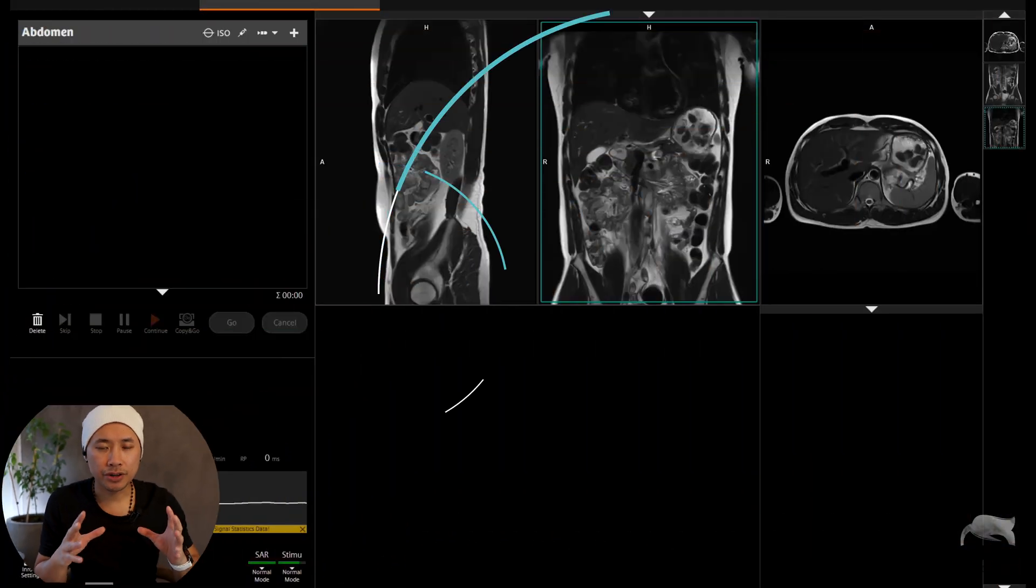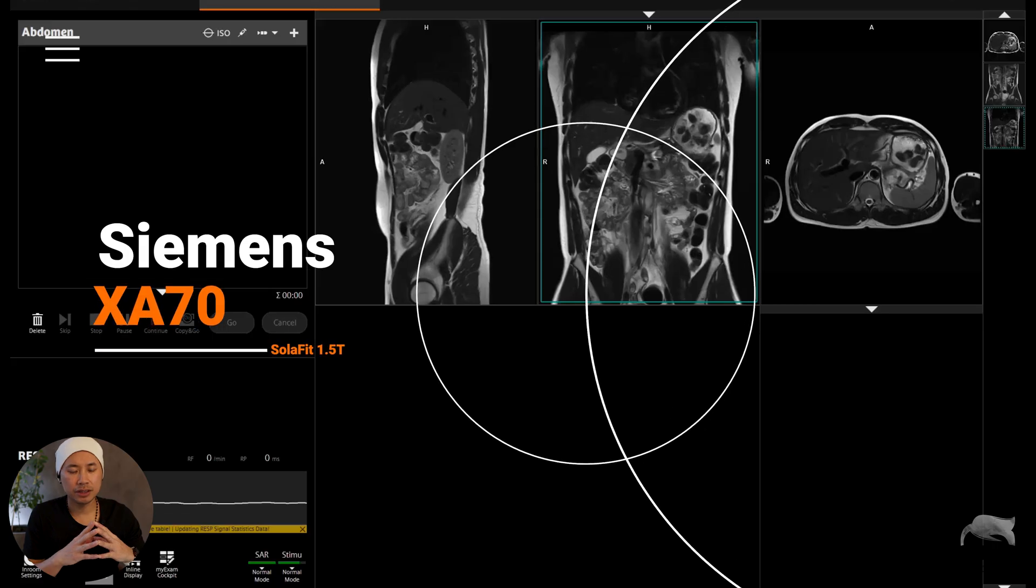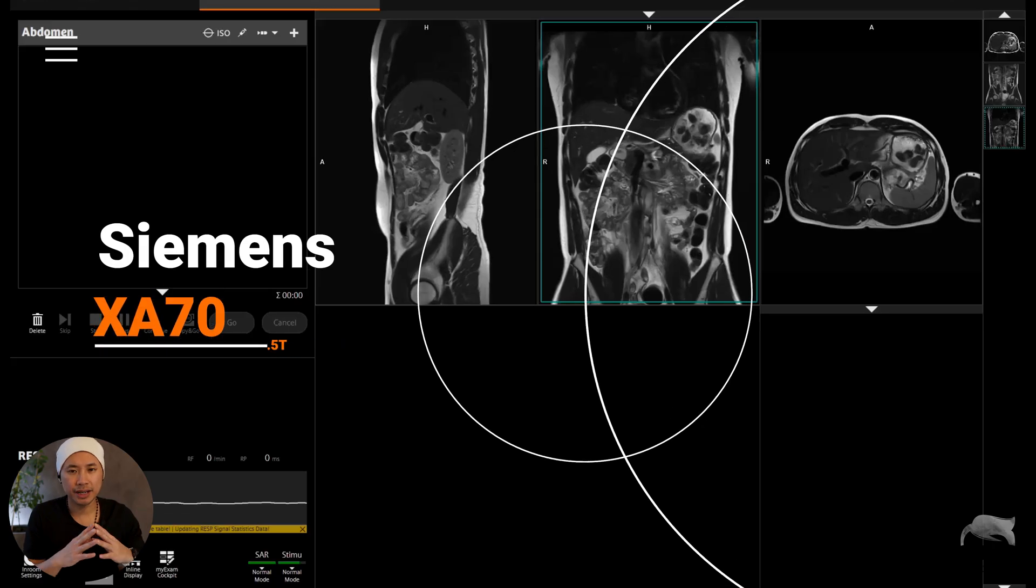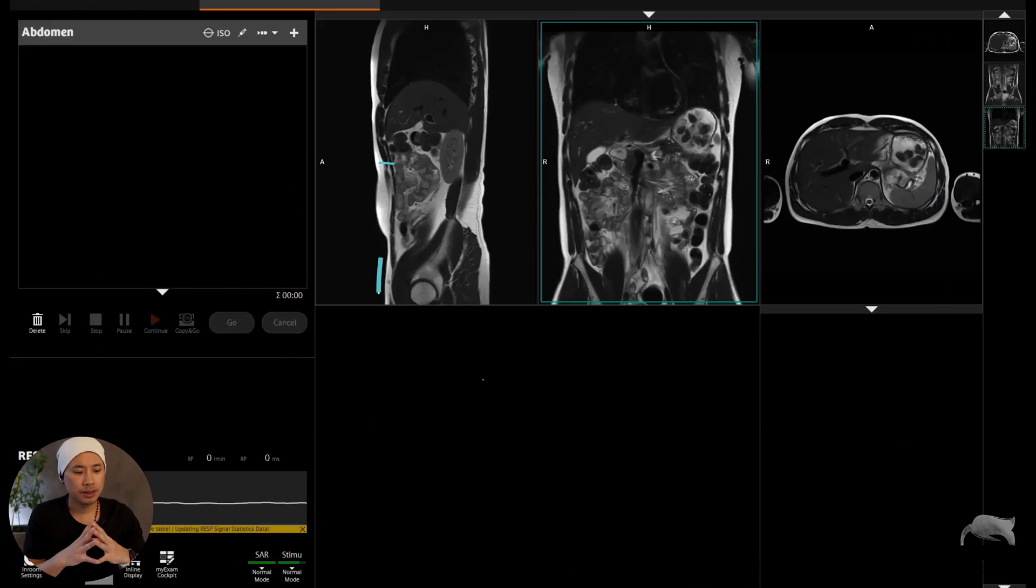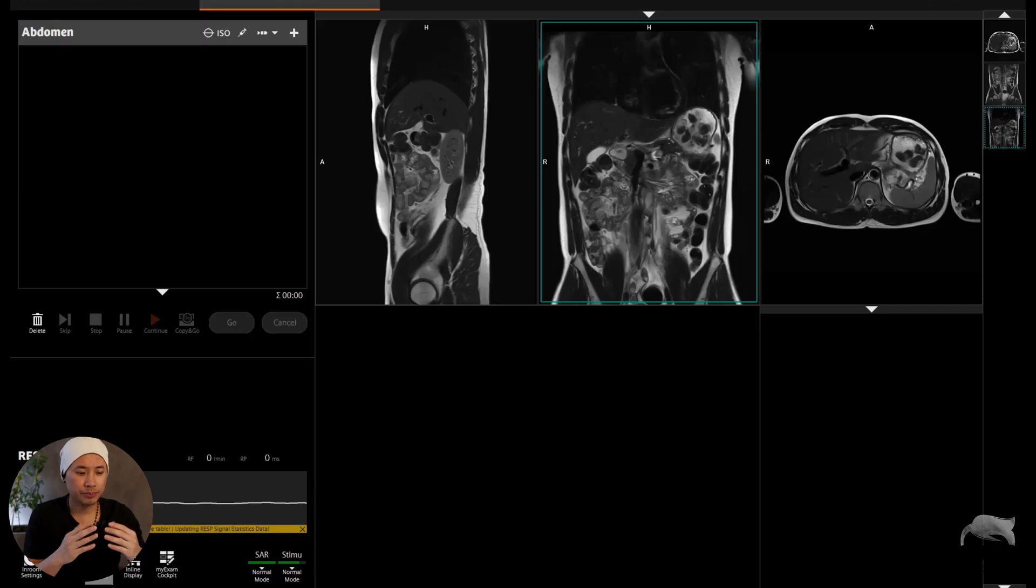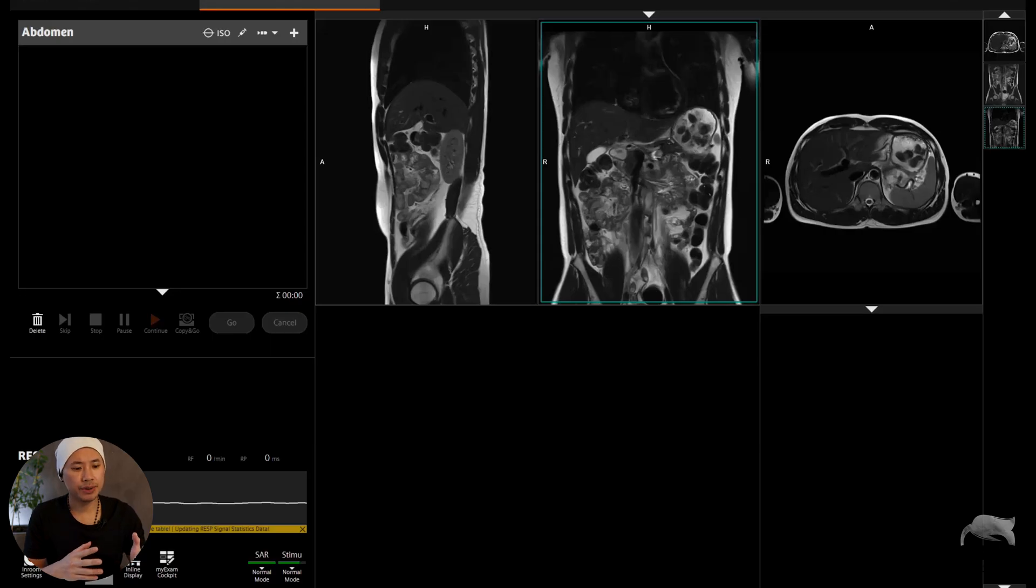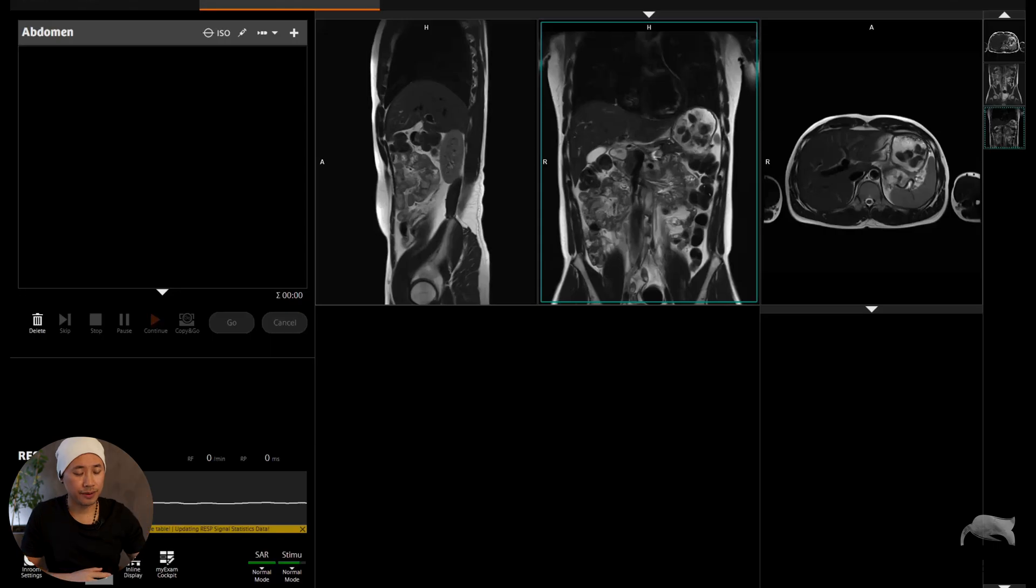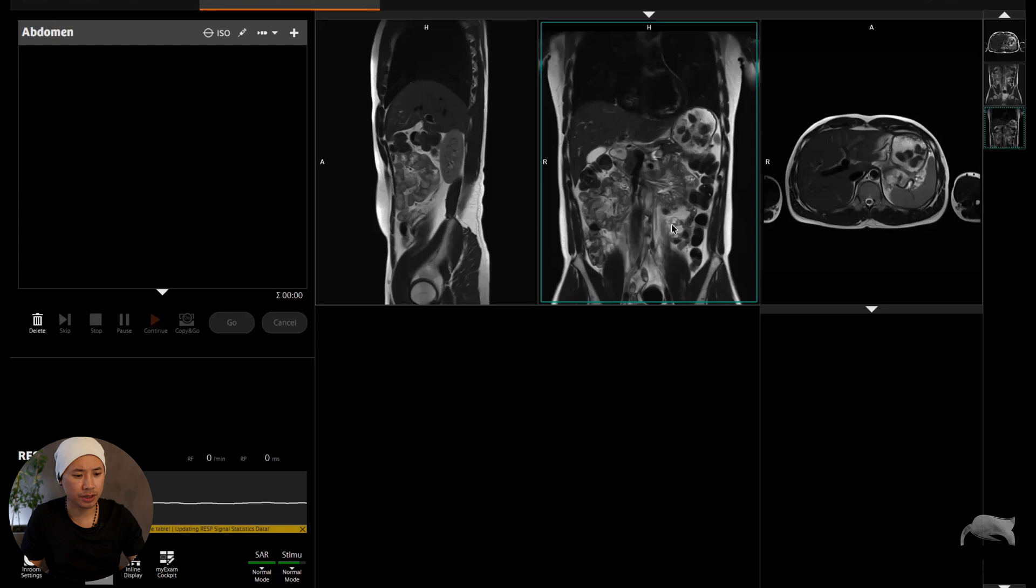Alright, we are currently at the 1.5T Sola. It doesn't matter, it will work anyways if you are 3T or lower field. However, we are at syngo XA70 and it will be working on previous versions as well. As you can see in front of you here, we had a localizer right here. It's a very large area of coverage.